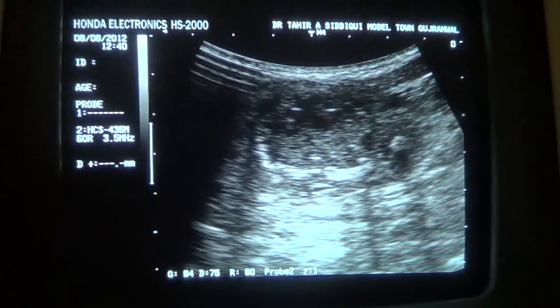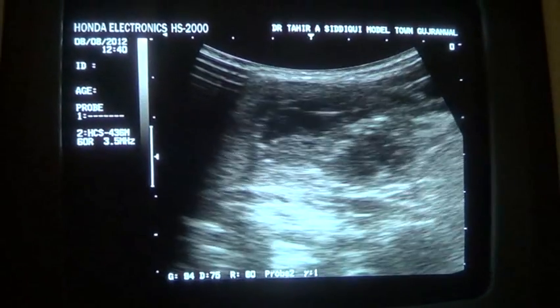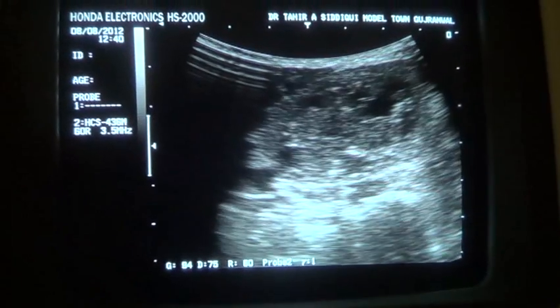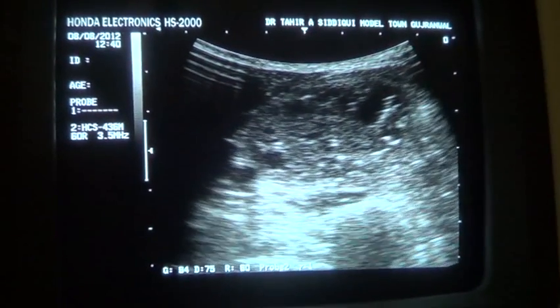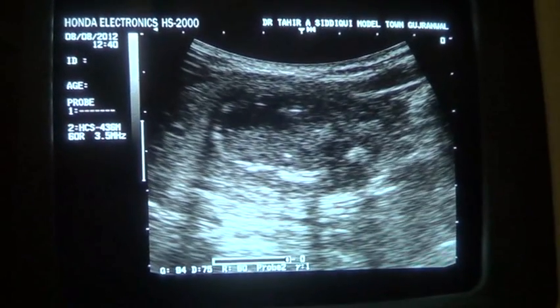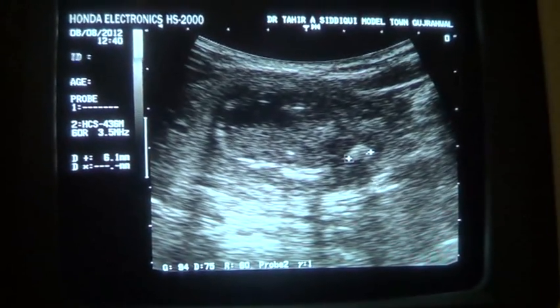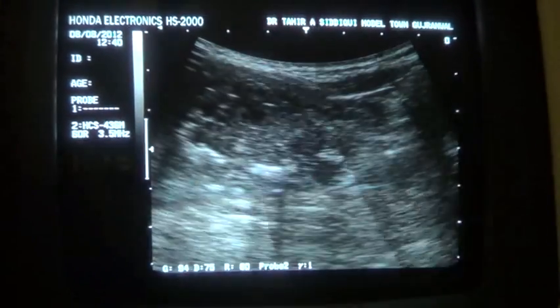This is the eggshell sort of rim. There are internal, peripheral, multiple, uncountable shadowing and non-shadowing echogenicities. As you see, this is the largest one, measuring approximately 6.1, and giving posterior shadow, as there is a cystic area within.